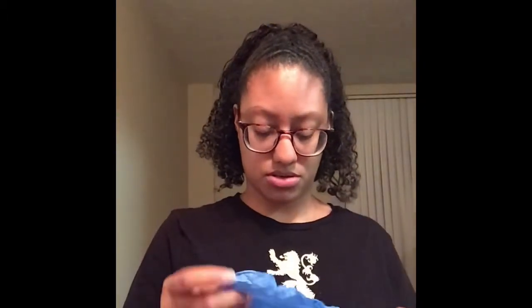doing your procedure. Next thing we are going to do is perform hand hygiene. Going to put on our gloves. Make sure you have a garbage receptacle with you. And we are also going to make sure that we provide privacy for our patient and make sure that we are exposing as little as possible when it comes to doing a dressing change and irrigation.